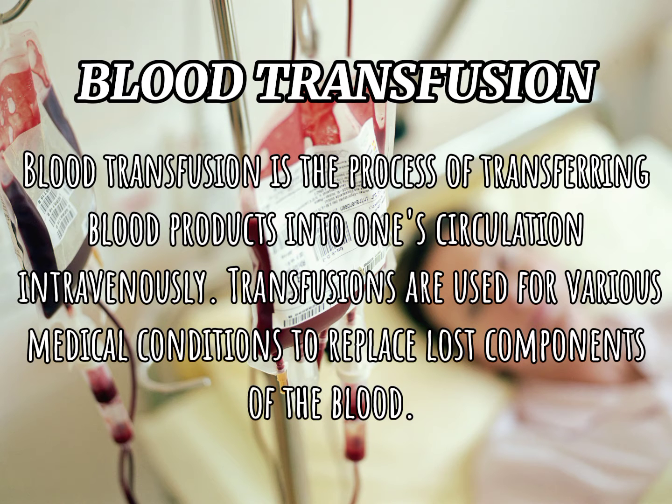Blood transfusion is the process of transferring blood products into one's circulation intravenously. Transfusions are used for various medical conditions to replace lost components of the blood. First, we need to verify.